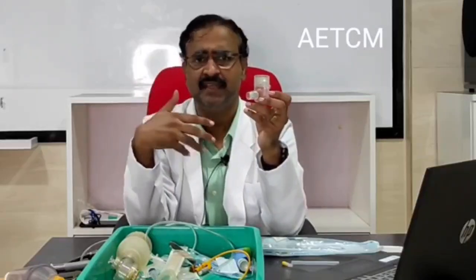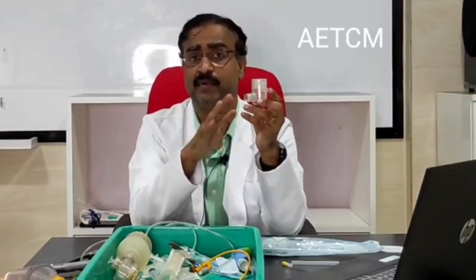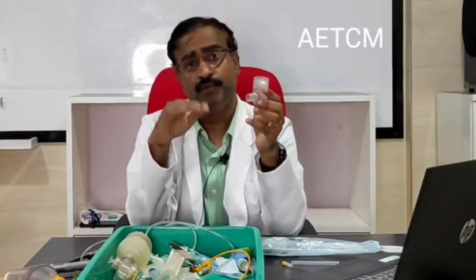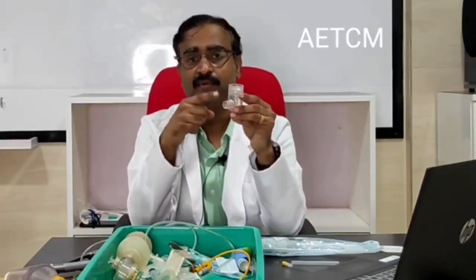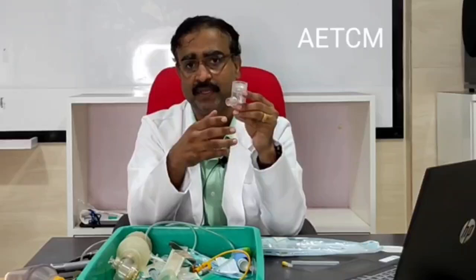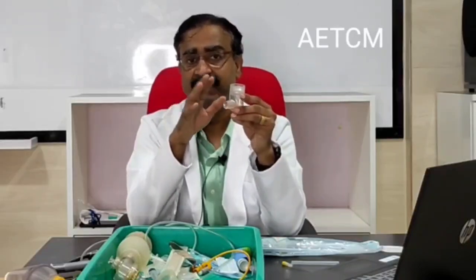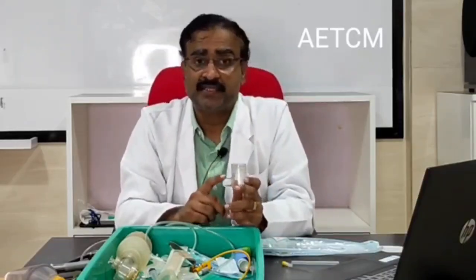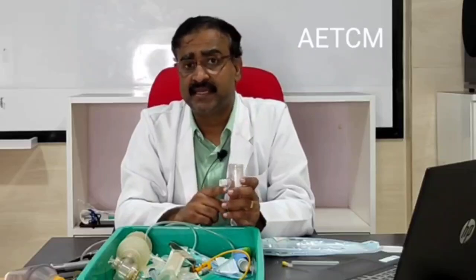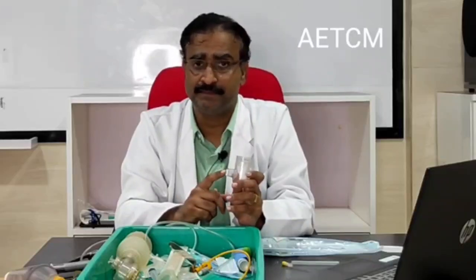How would the child know that the procedure is being done properly? You need to advise the child that the capsule that breaks into this apparatus will start moving in rapid rotations. You can hear that sound. That would tell you that the drug is probably getting administered effectively. For this, the child's cooperation is mandatory. That means a child younger than 7 to 8 years may not be able to do this properly.